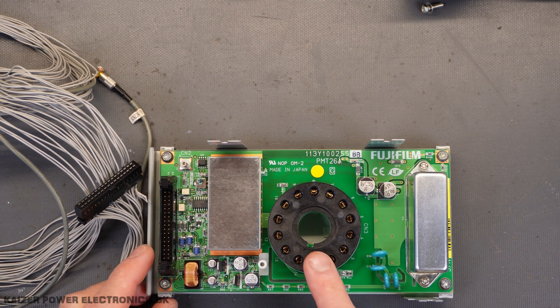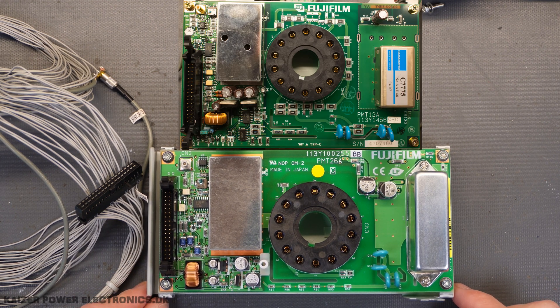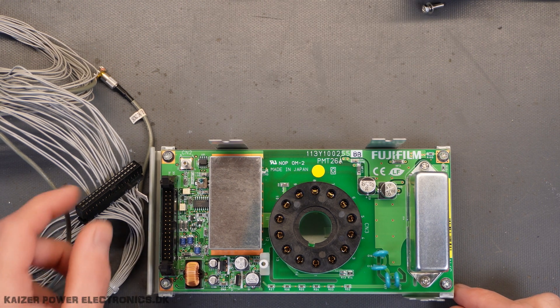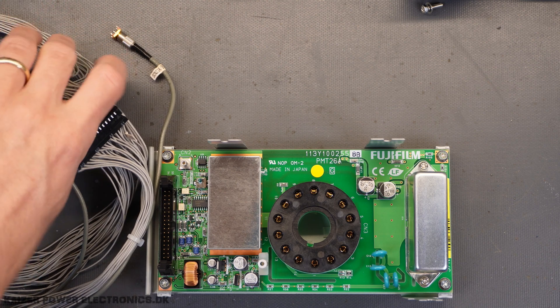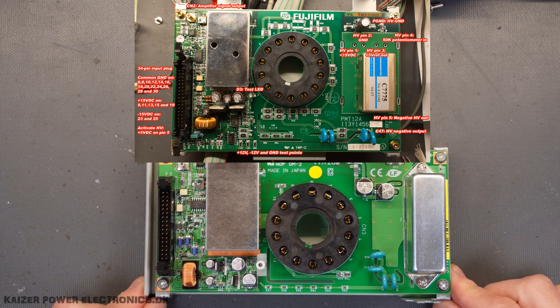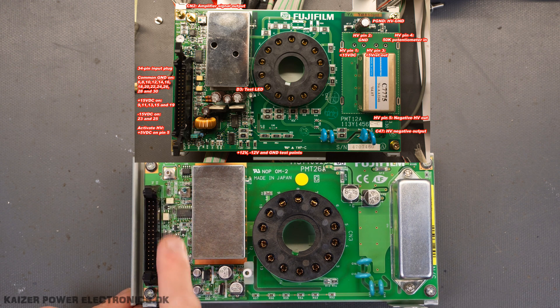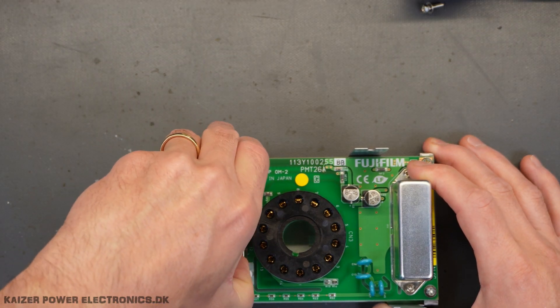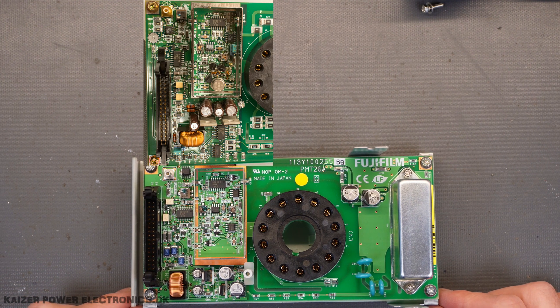The high voltage power supply connectors for the tube socket and the analog amplifier seem very identical to the PMT12A that I have taken apart and reverse engineered earlier. It has this 34-socket pin header along with a small coaxial cable. What I want to do is compare this PCB with the PMT12A assembly, and as you can see, it is very much an identical layout — they did not invent something completely new. We can see a lot of the input/output and the power supply section is very identical, and if we peek into the analog amplifier section, we can also see that the layout and even some of the IC names is actually the same.